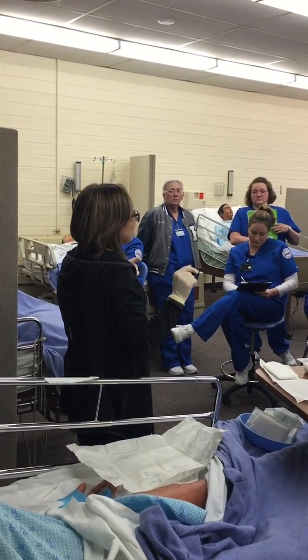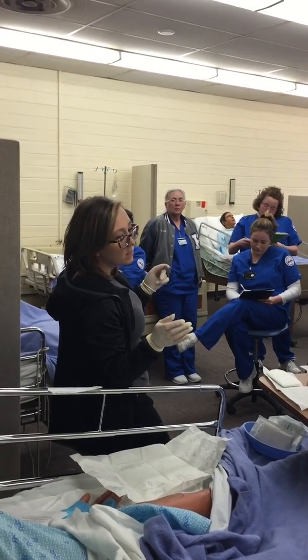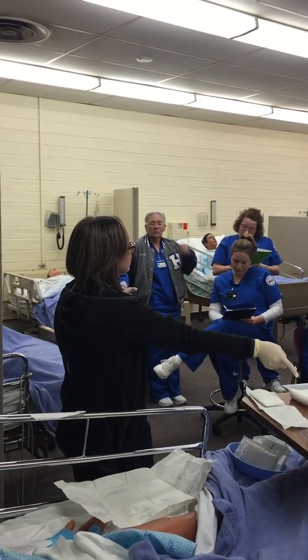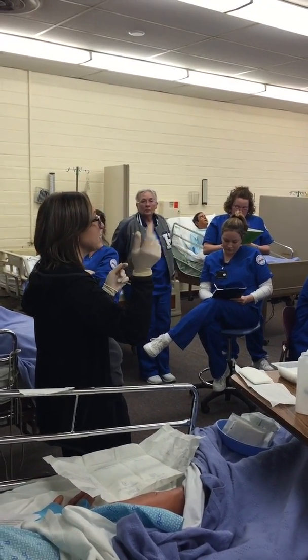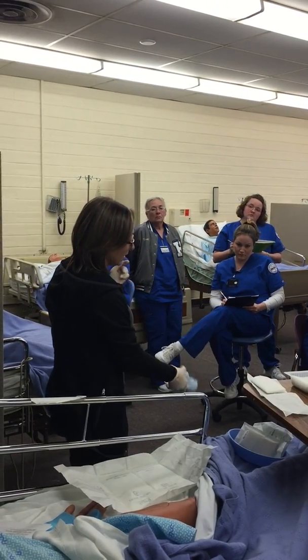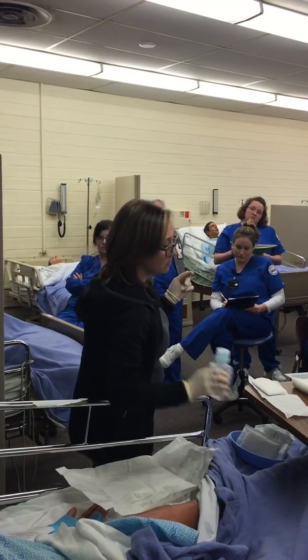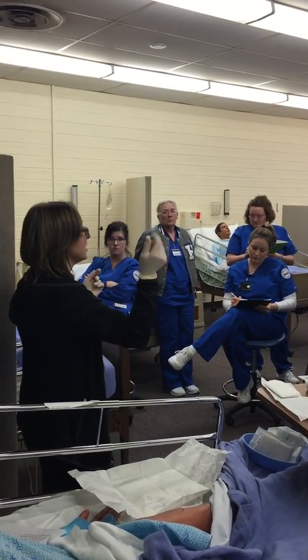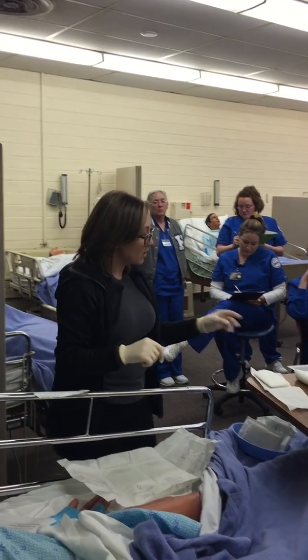Because right now, if I had to do a wet to dry, I would have to re-lip my stuff and saturate these. Okay, which I could do because is this hand sterile? No, so I could actually come over here and lip that, put it over here, or put some in here, and then put it over here, because this is no longer sterile, right? So I'm going to go ahead and pack him.